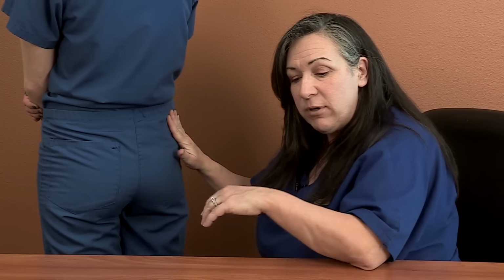Every now and then I do get requests, do I have to use a 1.5-inch needle? Can I use a 1-inch needle? I do use a 1-inch needle on my really small patients. But remember, I need this to get into the deep tissue, so it doesn't serve our purpose to try to make things easier for you sometimes. But for those gals who are 105 pounds and just little tiny things, a 1-inch needle is acceptable to do. And that is an intramuscular injection.